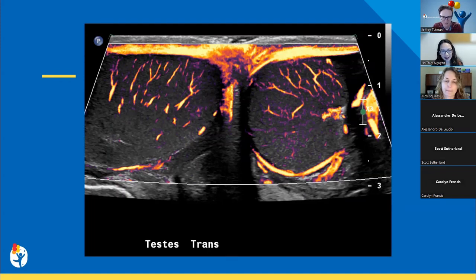Yeah, same here. I think a lot of our contrast ultrasound is reserved for outpatient settings, just working up things that are routine. And so I don't know how that would play a role in implementing it into the workflow. And then would you be on patient call for it? So I think it's cool, but I don't know if I really want to take call for contrast ultrasound on top of everything else. All right, cool.